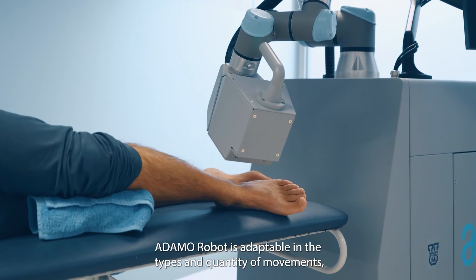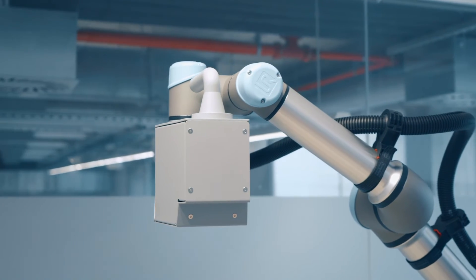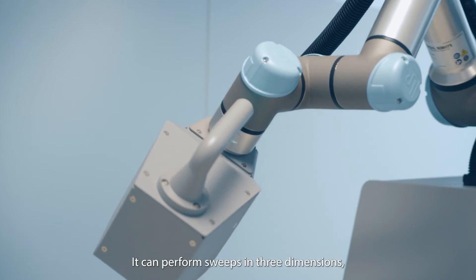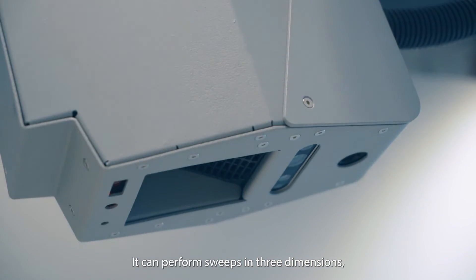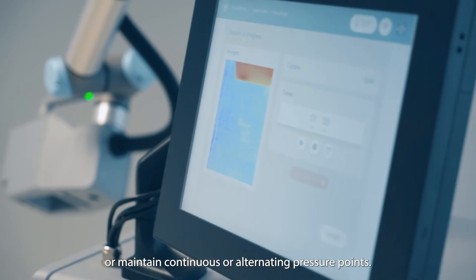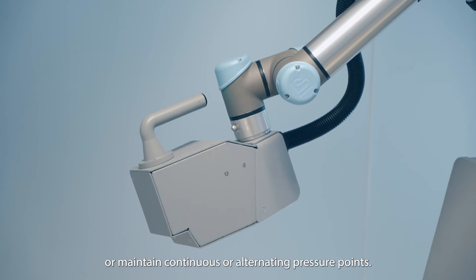ADAMO Robot is adaptable in the types and quantity of movements which are not replicable by other devices. It can perform sweeps in three dimensions with linear or pendulum-like directions or maintain continuous or alternating pressure points.